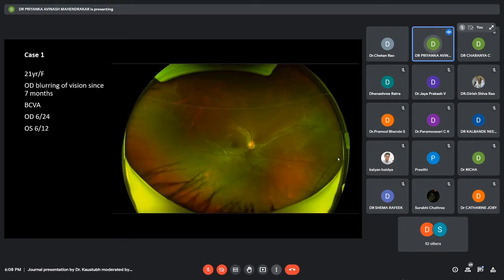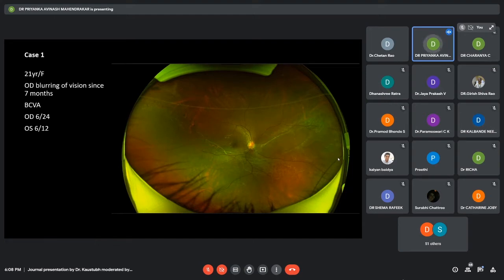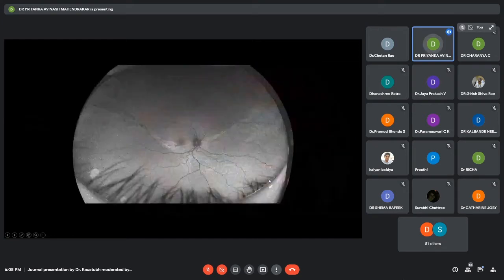The first case was a 21-year-old female who came with blurring of vision in the right eye since seven months. The best corrected visual acuity was 6/24. Here we can see the patient has a chronic RD. We can see a demarcation line on the color photo and we can see some subretinal gliosis over here.